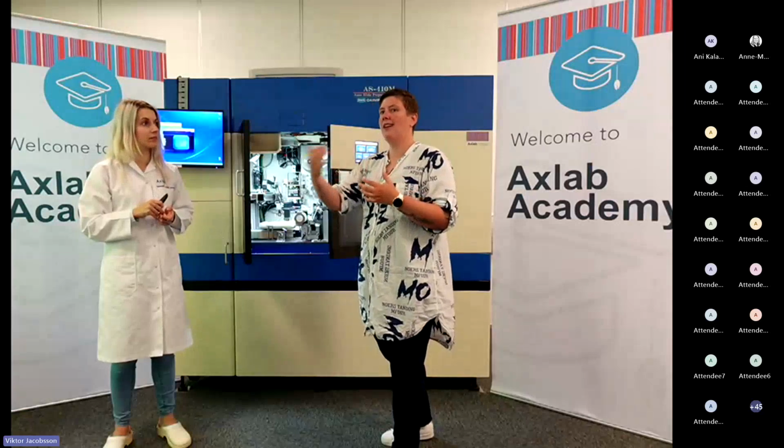Do we have another question? Can you run 3 samples that require 3 levels? Yes, you can do that. The only thing there is, and the reason why we are not doing it, is because you have to have the different levels on different slides. So you use more consumables on slides. And for us that are fully digital, it will be more slides that we have to scan. So we are putting on more scanning time. And that's the main reason we are not doing different levels. But I don't know if there is a limit to how many levels you can.